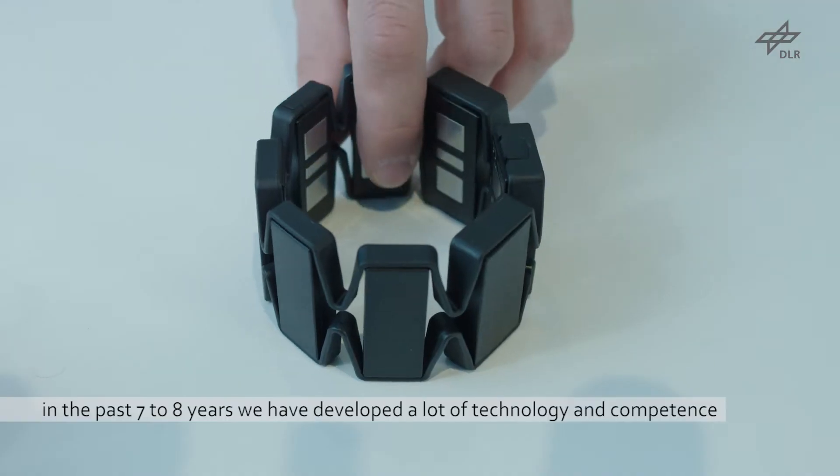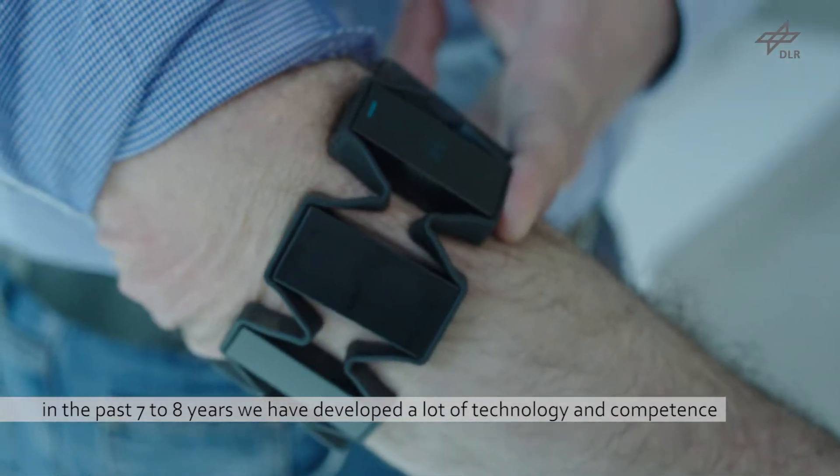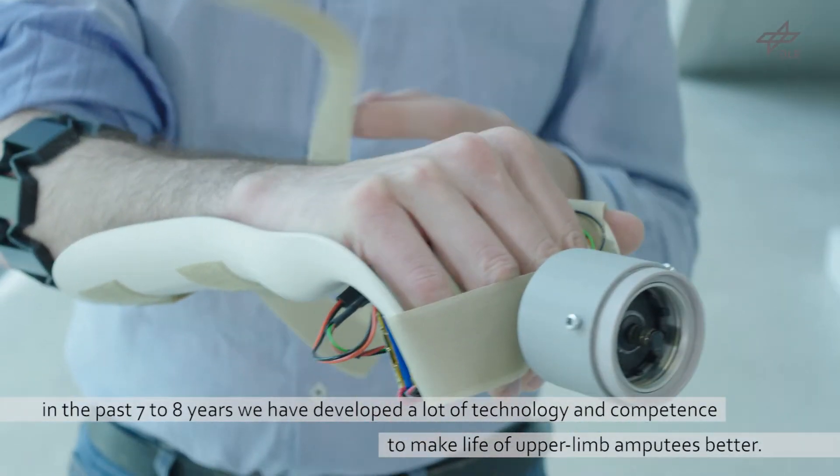In the Department of Cognitive Robotics here at the DLR in Oberpfaffenhofen, over about seven to eight years we have developed a lot of technology and competence to make life of upper limb amputees better.